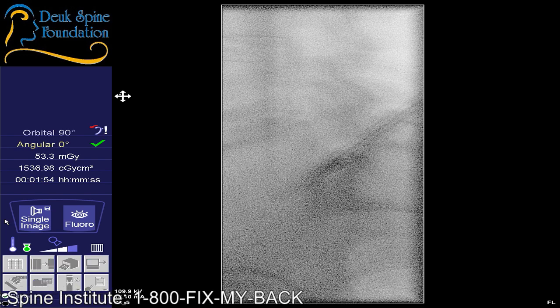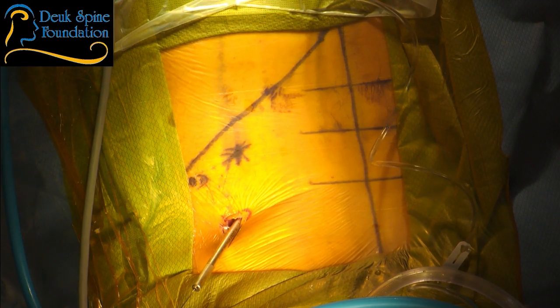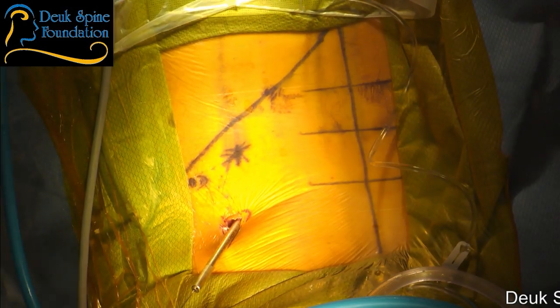Shot. All right, so now the guide wire is trapped and it's advancing. We don't want that. So I'm going to pull it back gently. Shot. All right, good. I'm going to go a little bit further in, and I think we're good at that point.